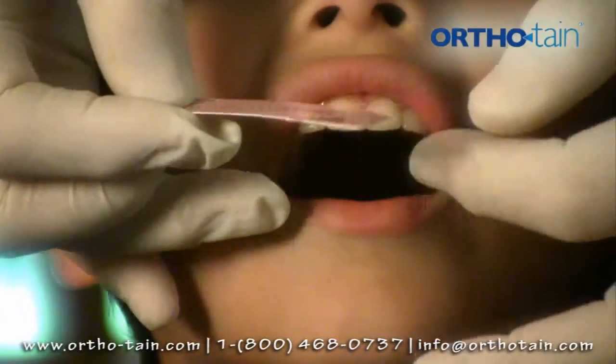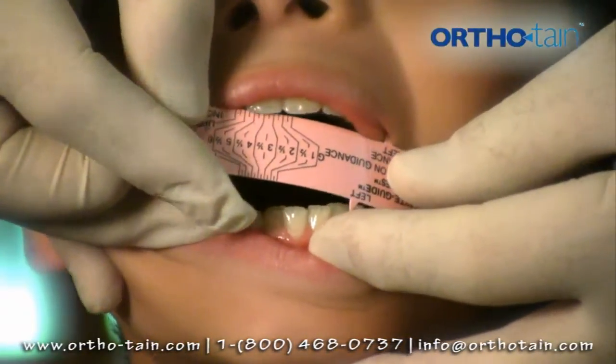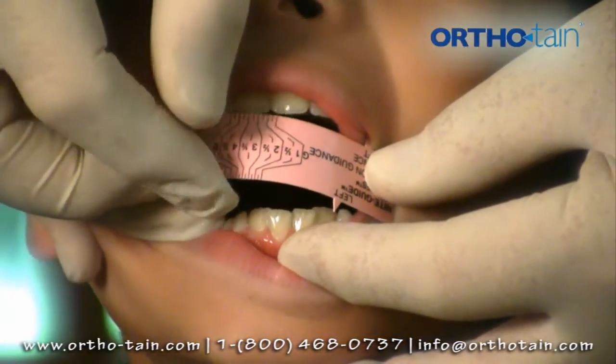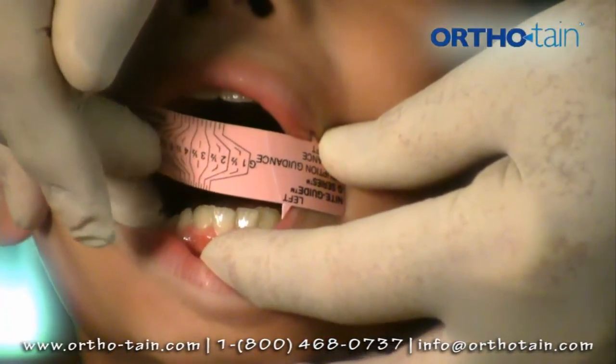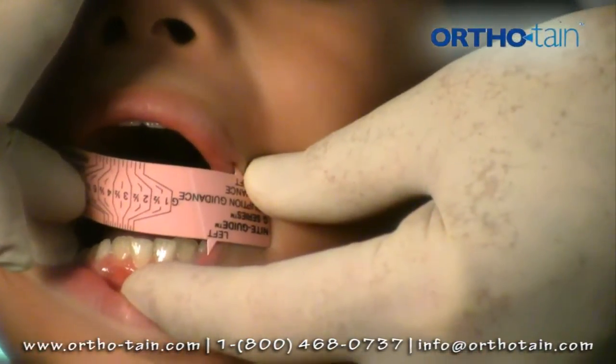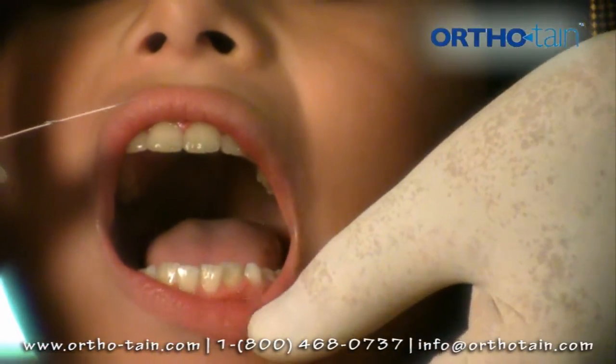We can also measure the lower teeth the same way by putting the pointer on the left lower lateral incisor and running it along the incisal edges to the other side. We get a slightly smaller measurement because he has some crowding, but a five and a half would fit both.